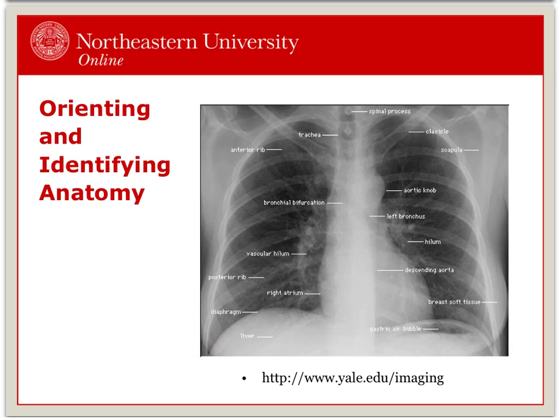We look at the fields of lungs for any masses or infiltrates. Note the gastric bubble in the stomach on the left, the hilum, and the vessels. On inspiration, it should be possible to count the 10 posterior ribs. There's your first anterior rib: 1, 2, 3, 4, 8, 9, and 10. And all that jazz is looking for any lines, tubes, implants, prosthetic valves, or foreign objects. Take a moment to review the anatomy.